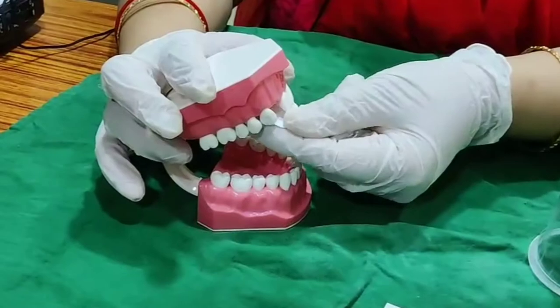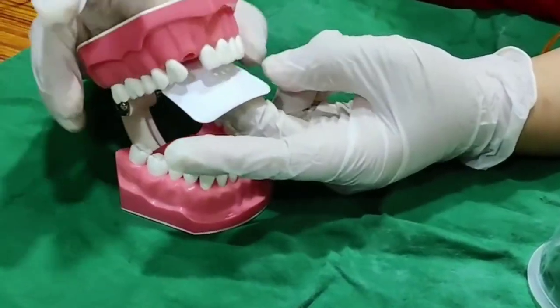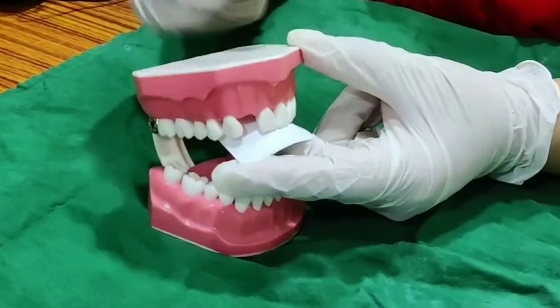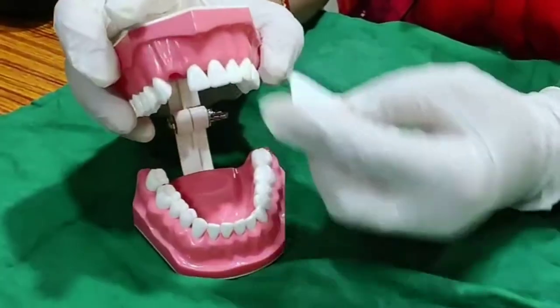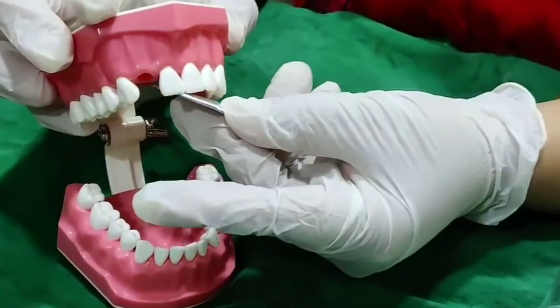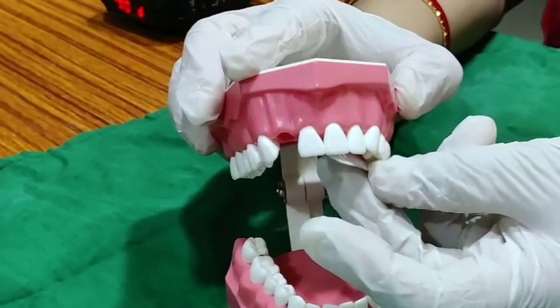Another error is incorrect film positioning. If the patient is not opening the mouth well and you position the film too shallow, the root will not appear on the film. The arbitrary length of a complete tooth is 21 to 25 mm. If part of the film is unexposed, that portion of the root cannot be captured. For canines with long roots, change the film to vertical orientation. The complete film must cover the entire tooth. For diagnostic, the film should be placed 1 to 2 mm above the tip of the tooth; for endodontic, push it further inside.